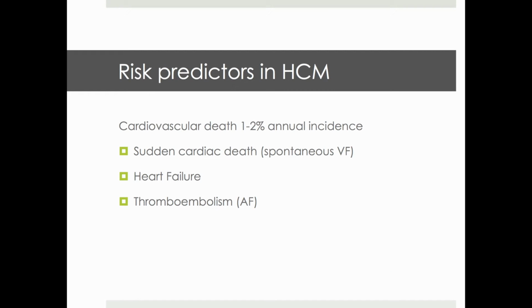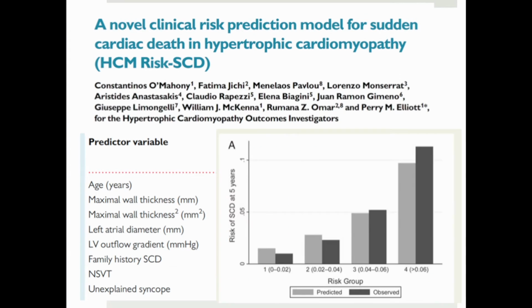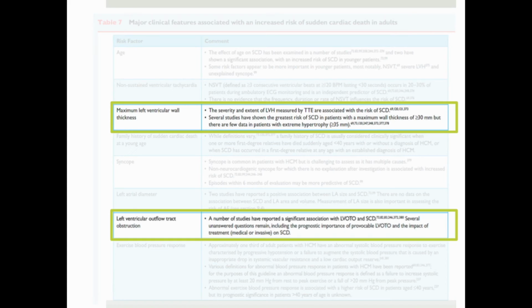Hypertrophic cardiomyopathy is associated with an increased risk of cardiovascular death. The sudden and unexpected nature of these events in apparently healthy young people provides a compelling argument for search of predictors that would help to identify those at risk and prevent such events. The current guidelines foresee 8 major clinical features which have been established as valid predictors in a large observational longitudinal multicenter study. Although not assessed directly, the 2 imaging markers among the predictors can also be obtained with cardiovascular magnetic resonance.